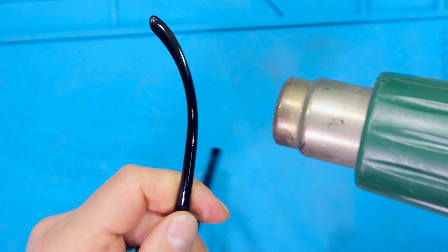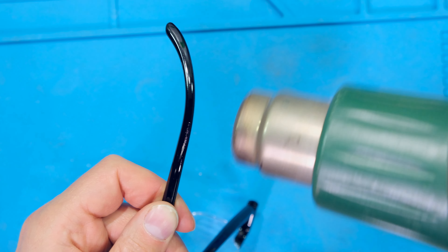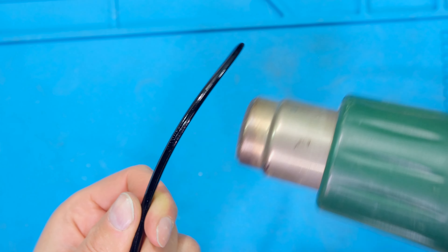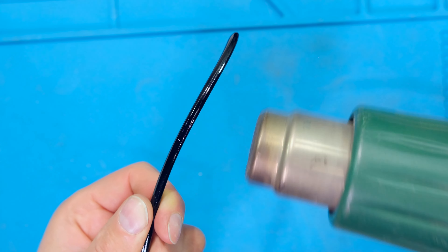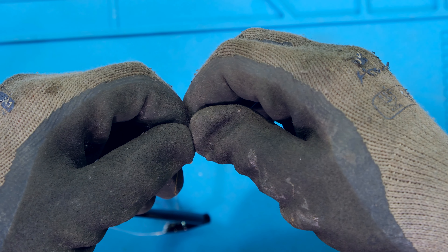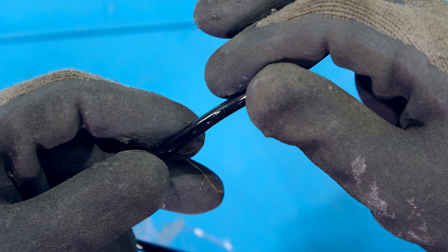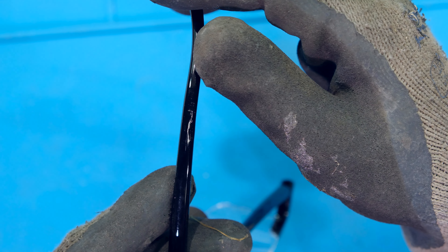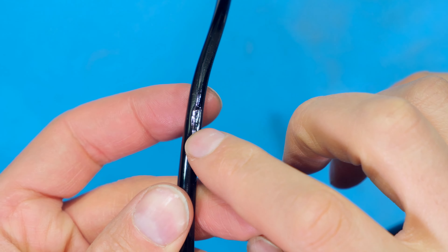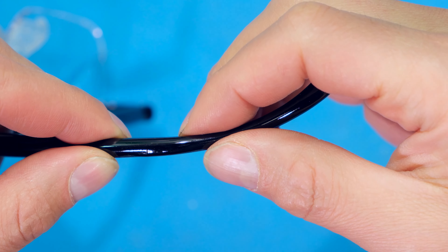The next tip: don't heat it up too much. If I heat it up too much when I put my fingers there I might even bend or deform the plastic just with my fingers. In this case I've heated it up quite a lot and I'm going to try to bend it — and the minute I put my fingers here, look at that impression that is now in the plastic. We don't want that — it's because it was too hot, then my fingers came and deformed the plastic, and that's a sign that I'm too aggressive with the heat.